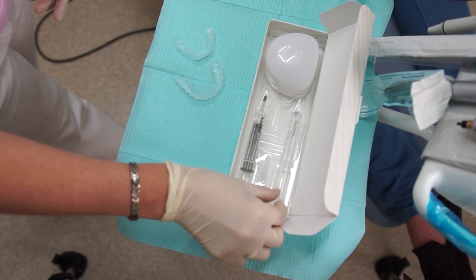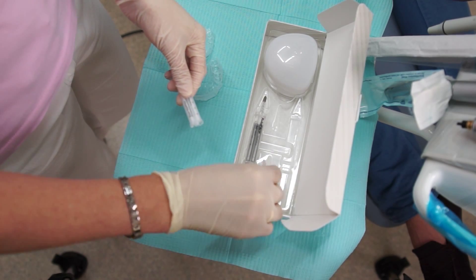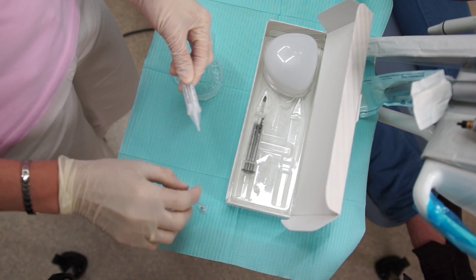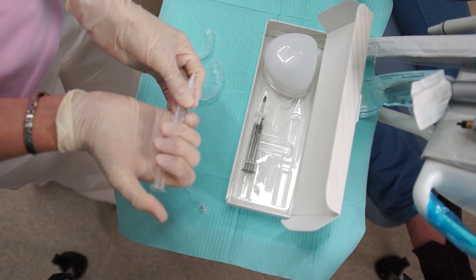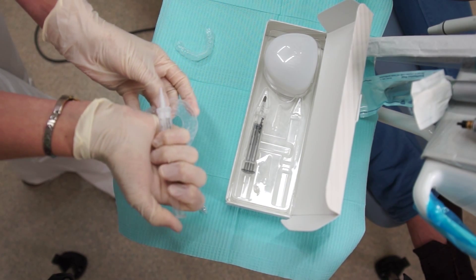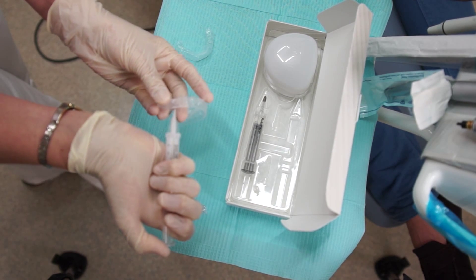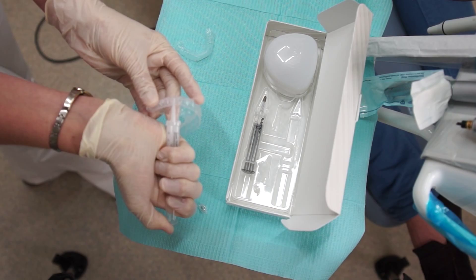The take-home gel is properly instructed to the patient: how to apply the gel and how to put the drops of whitening gel into the take-home trays. A small amount of the gel is extracted out prior to inserting into the gel trays — a very small drop on the outside of each tooth position in the tray.